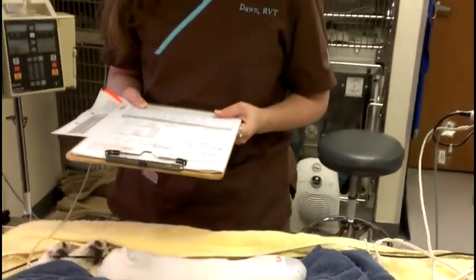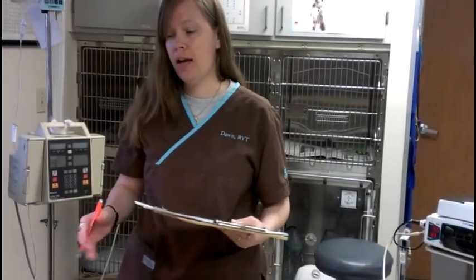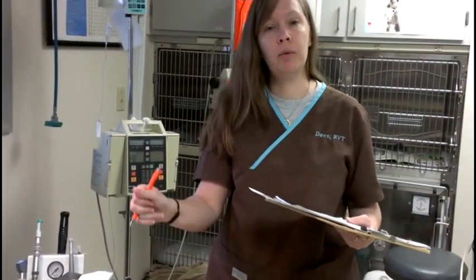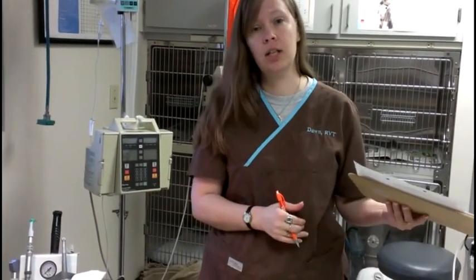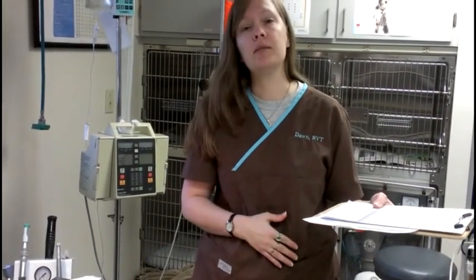Another important factor is body temperature. Anesthesia can cause the body temperature to get low, as can IV fluids. And the fact that we're working around the mouth with water while we're cleaning her teeth, all these factors can lower her body temperature. So we want to keep that body temperature as normal as possible.